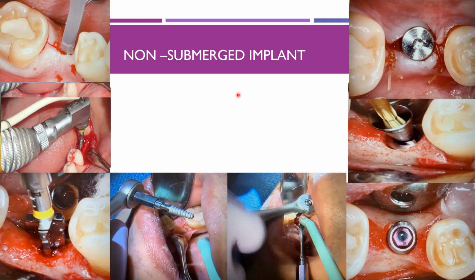So for this non-submerged implant, in the same way the midcrestal incision has been given, and then after the lancer drill, the pilot drills have been given with varying depths. After reaching the desired depth, the osteotomy site will be extended with different pre-drills, extension drills, to reach the desired width of the implant, and then the implant has been placed.